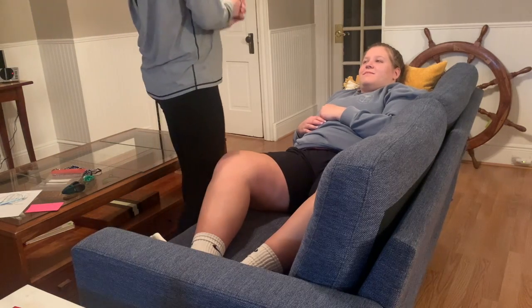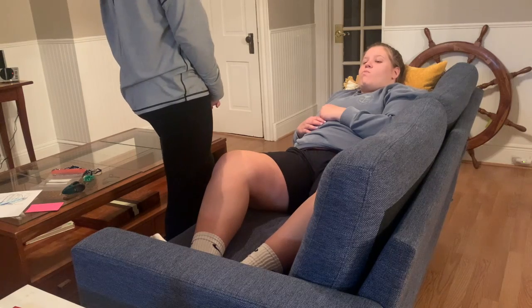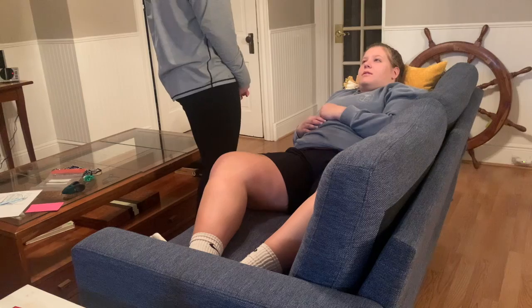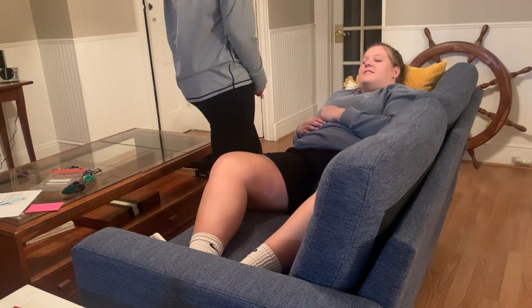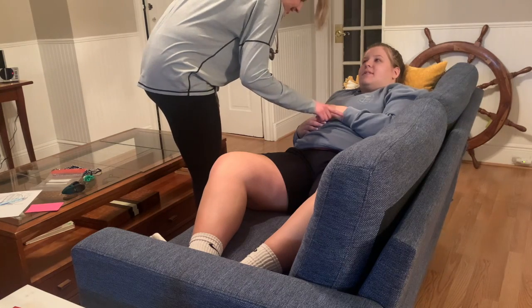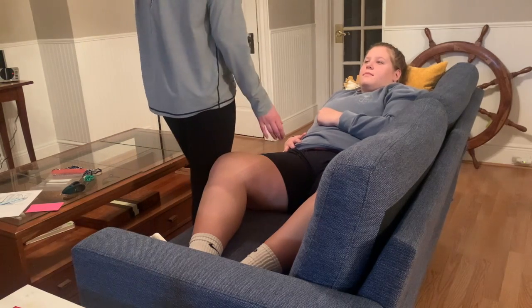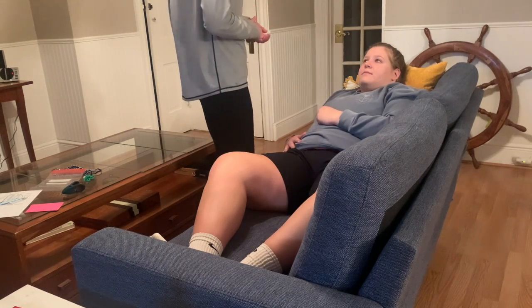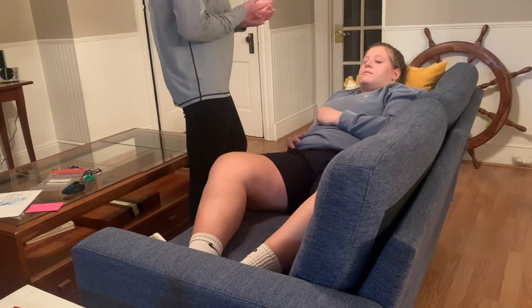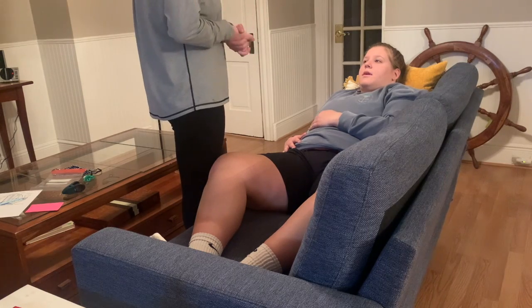Hi, Gene. Hi, how are you today? Good. I'm Rebecca. I'm going to be the student nurse working with you. Can you tell me your name and your date of birth? Can I just check this bracelet here? Are there any allergies I should be aware of? No. So today I'm going to be checking your oxygen levels and making sure we don't need to hook you up to oxygen to make you more comfortable. I'm going to be doing a bit of an assessment on you. Does that sound okay to you?